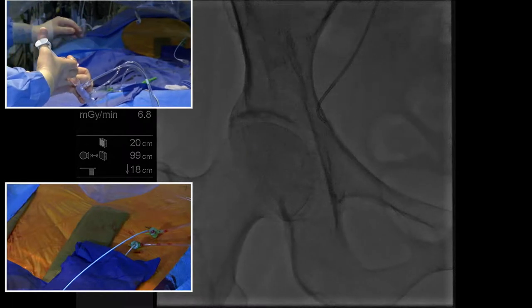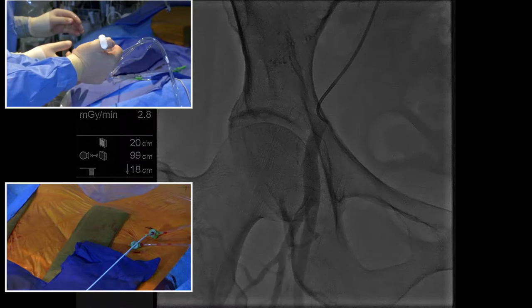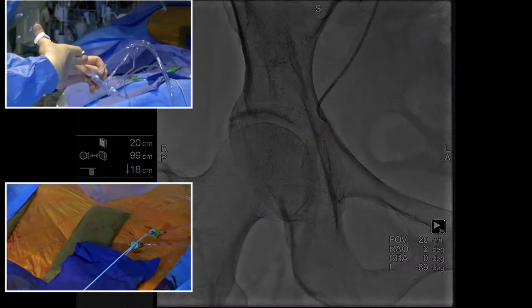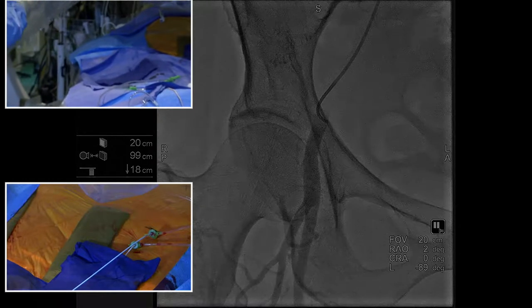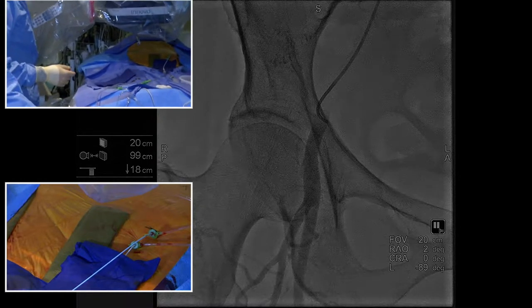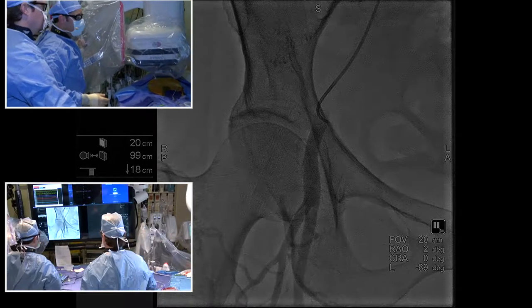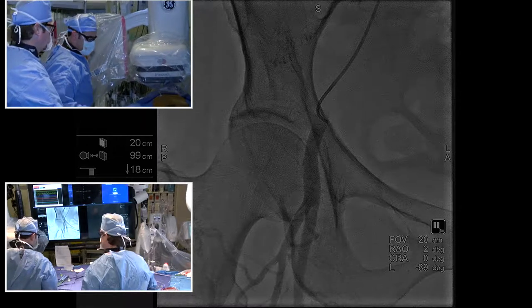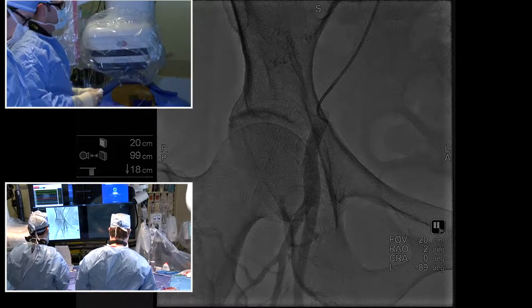So if you notice here, let's just do a cine here, just to show them for purposes of interest. So you see there's a bifurcation down there. I'm gonna let that play. So there's a split. That split is the bifurcation between the profunda femoris and the superficial femoral. We don't want to access either of those two vessels, okay? Because A, they're smaller, and B, they're typically in a location which is too distal for compression. So if there was a bleeding problem, we wouldn't be able to compress it.